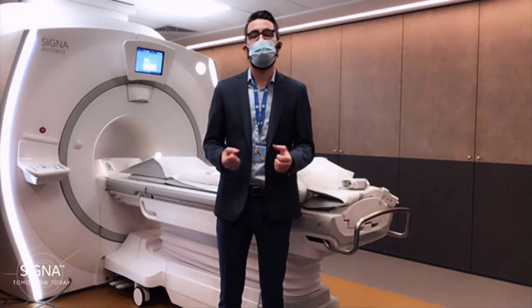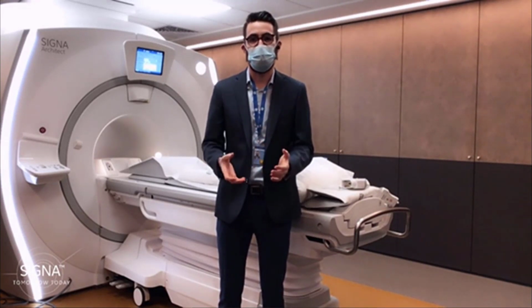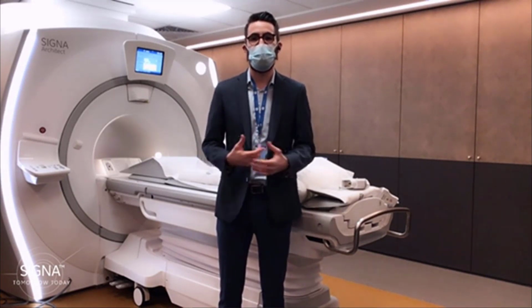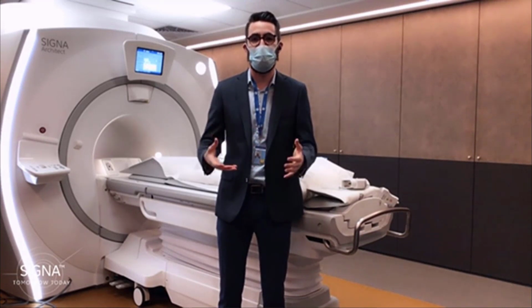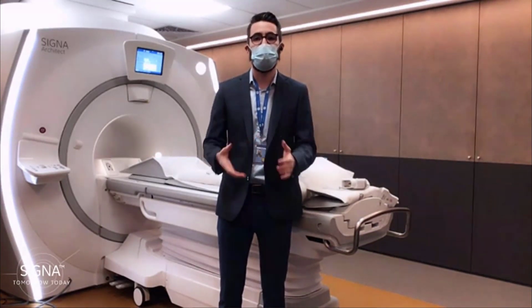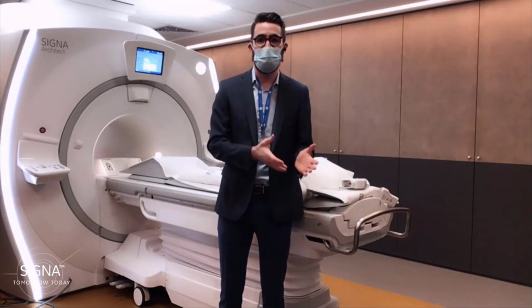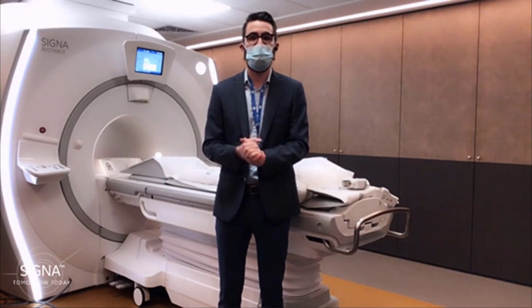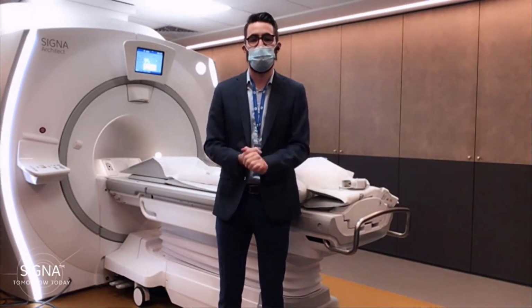It is a body-oriented software version. In it, we implemented a lot of developments and features in order to simplify the body examination for our customers and for our patients, and to generate more reproducibility and more clinical consistency. This is what we are going to cover.